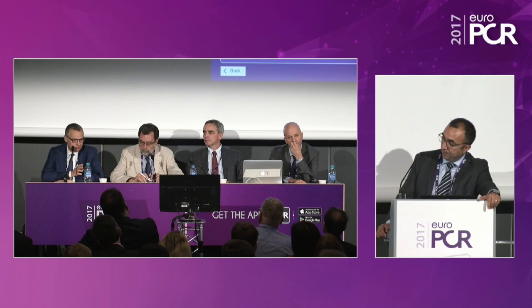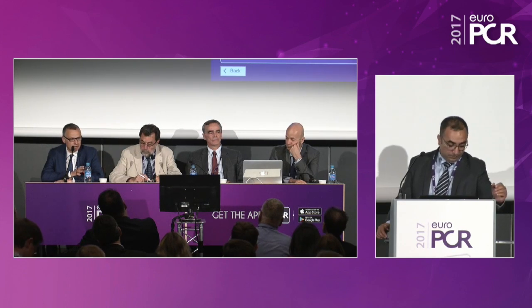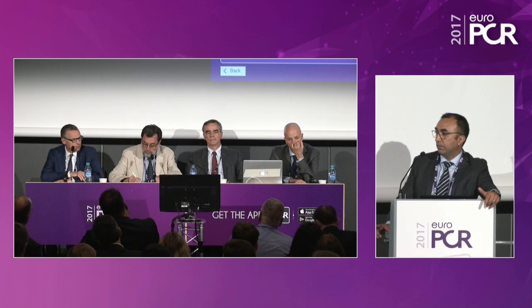You should avoid in the very early stage to treat patients with severe tethering because not all of them respond, although I would say some of them, even against the law of what we learn in surgery, respond well to this therapy. And to select the ideal patient to start with are the ones who have a very large atrium. They have a beautiful echo guidance, echo imaging. So this is the ideal patient to start your practice.